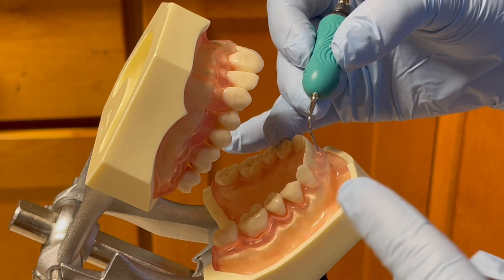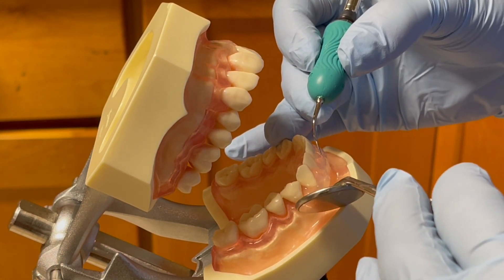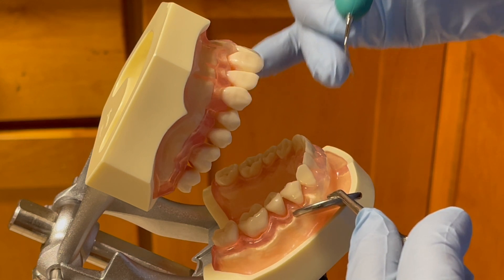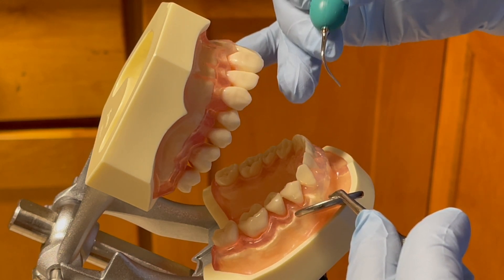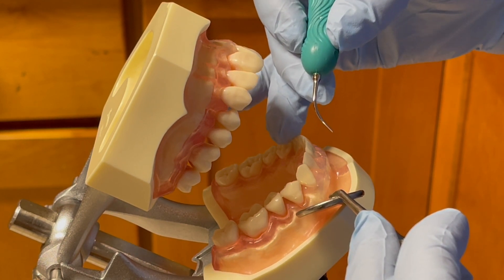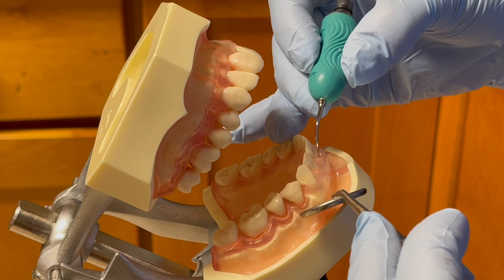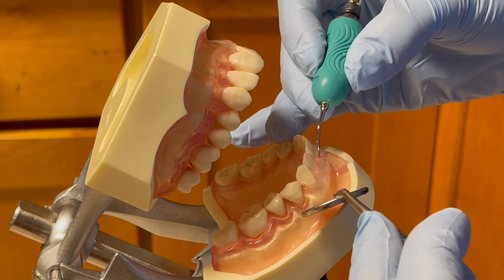For the non-dominant hand, I will hold a mirror for indirect vision or retraction. For the dominant hand, I will hold the ultrasonic handpiece with a light modified pen grasp and establish a stable fulcrum on a few teeth away from the working tooth. Before activating the USS, I explore with the USS tip on the tooth to locate any deposit.